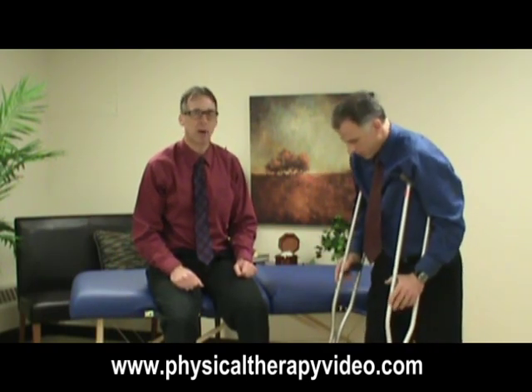Today we are going to talk about adjusting your crutches. You want to make sure you do it correctly because there are problems if you don't. Right now, Brad has these adjusted too high.